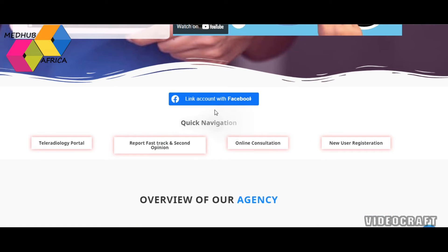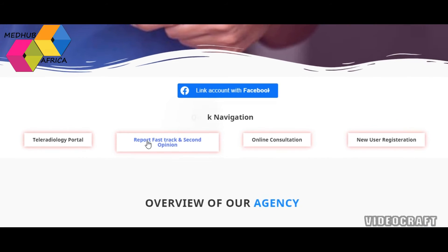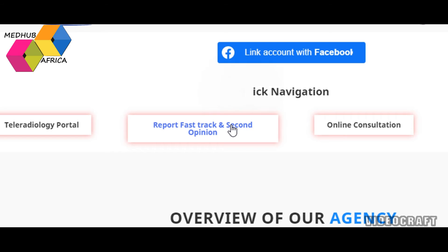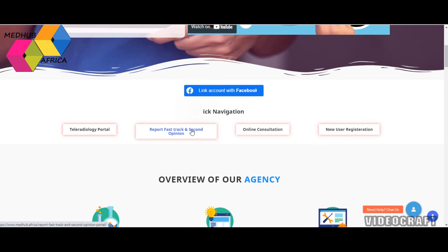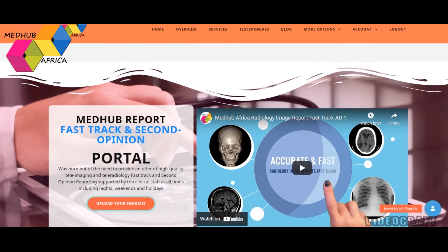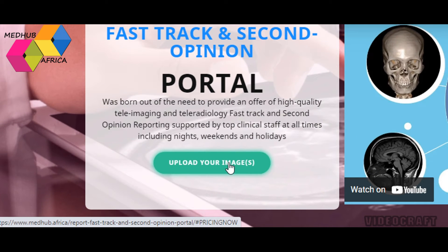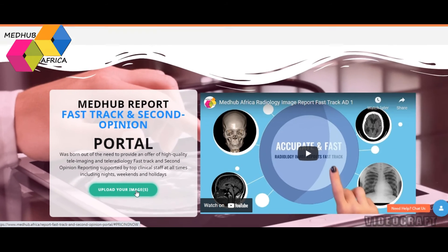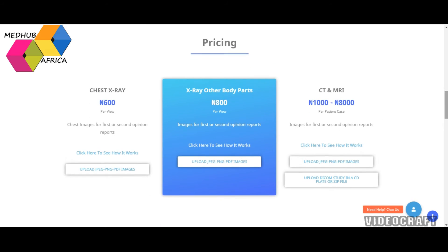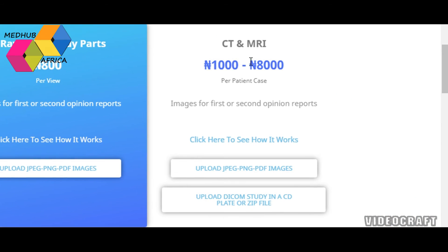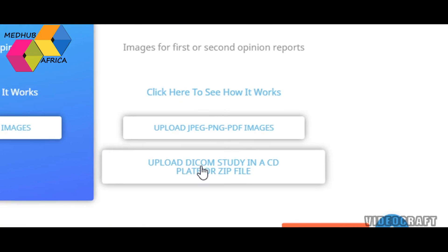Once you sign in with Google, if you can no longer see the Google prompt it means you're logged in. Next, click on the Report Fast Track and Second Opinion button. In the page that opens, select 'Upload your images.' You will be taken to the pricing section where you can select what you need to upload — this is for chest X-ray, this is for X-rays of other body parts, and this is for CT and MRI.